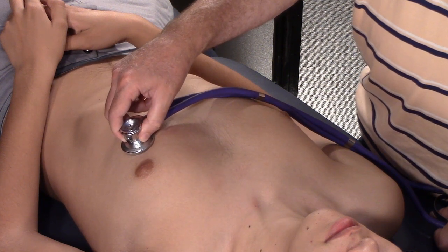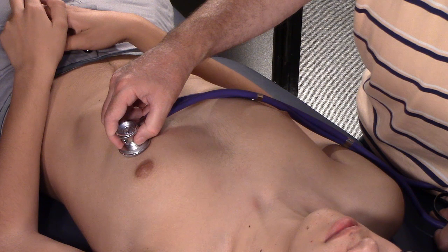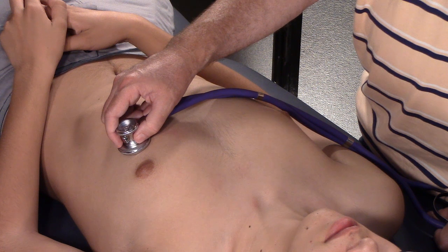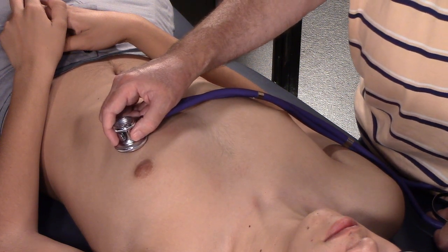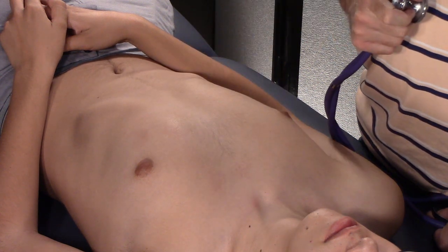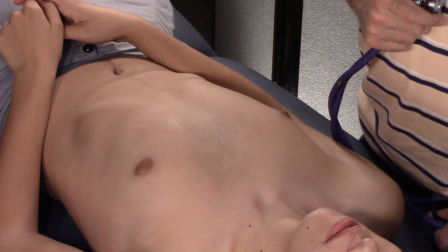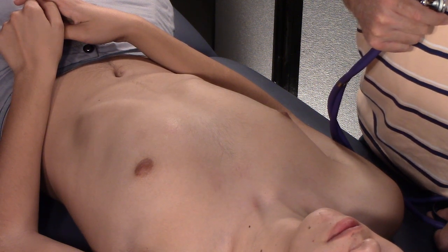If you want to hear the apical area better, put the patient in the left lateral decubitus position — roll them about 45 degrees (not 90) onto their left side and listen. If you want to accentuate the aortic or pulmonic valve, sit the patient up, have them lean forward, take a breath, blow the air out, and lean forward with their head down. That brings the base of the heart closer to the chest wall so you can hear those regions much better. Those are the two positions you need to know.